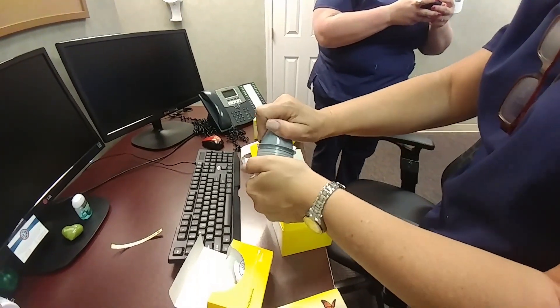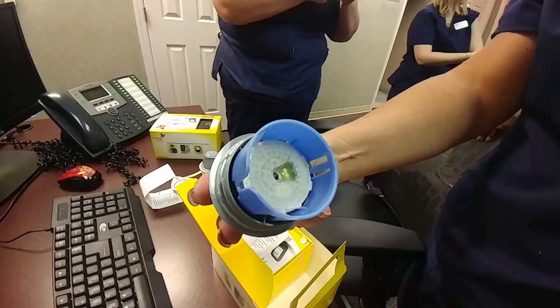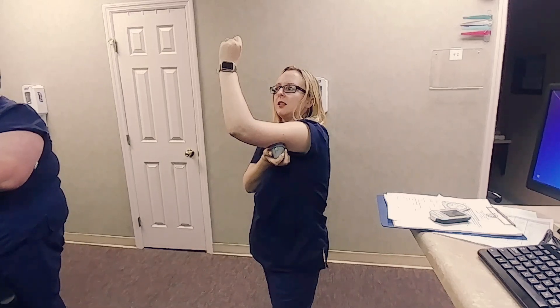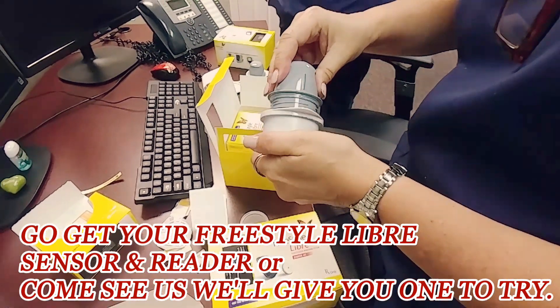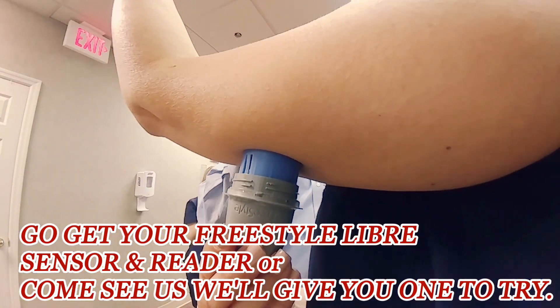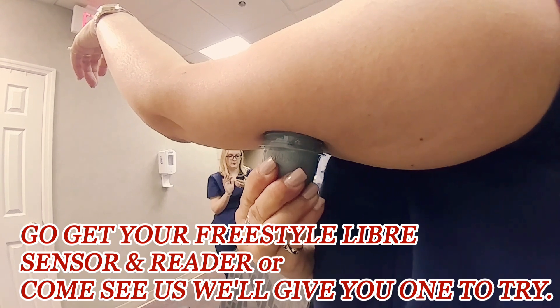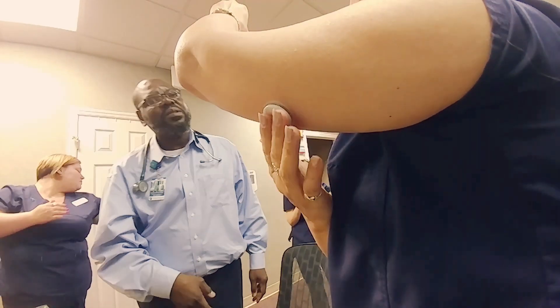There's the sensor. Pull straight up, press. You have to wait — count to 10, it doesn't hurt. It goes inside — don't muscle up, just relax. Press it. Count to 10, then run your finger around it, make sure it's set, then press it. There you go.